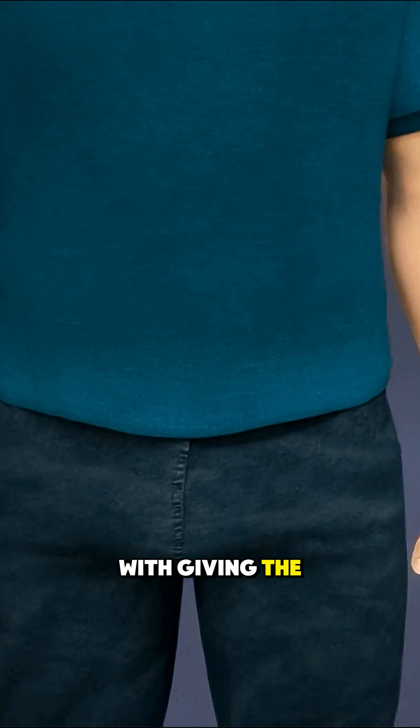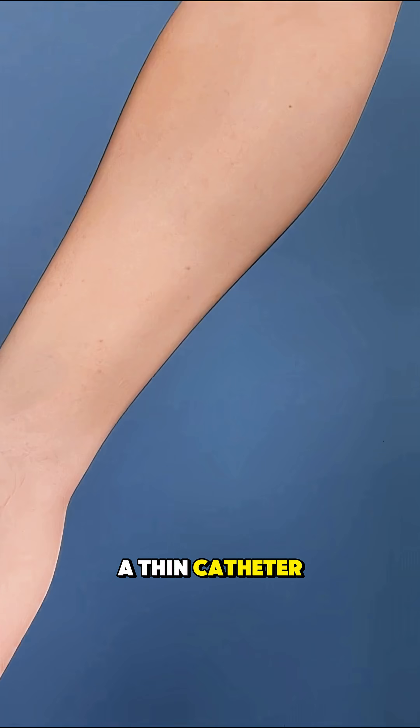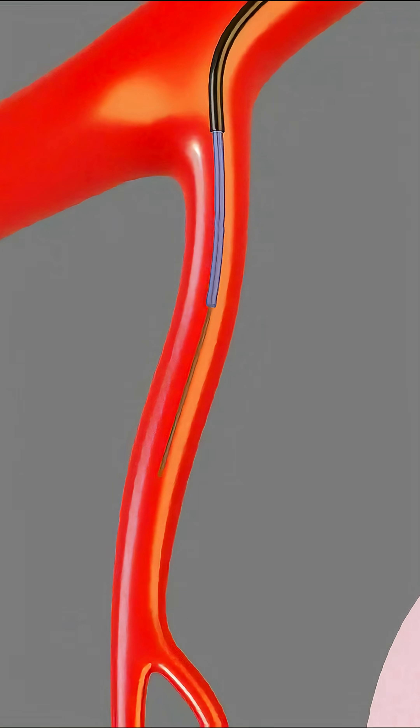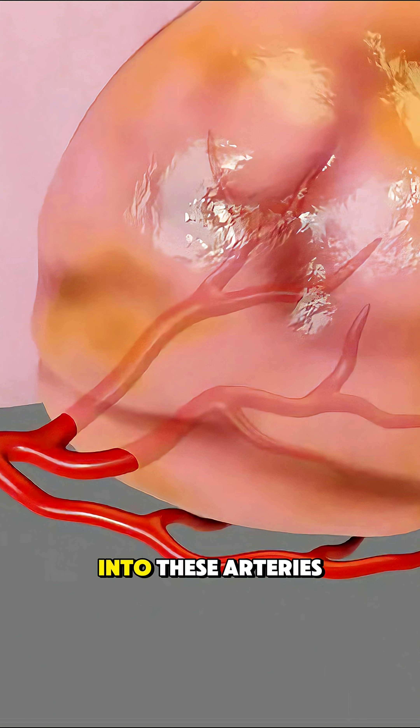The procedure starts with giving the patient local anesthesia. Then the doctor inserts a thin catheter into an artery in the groin or wrist and carefully guides it to the arteries that supply blood to the prostate. Once in place, tiny particles are released through the catheter into these arteries.